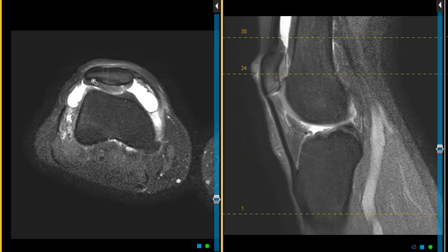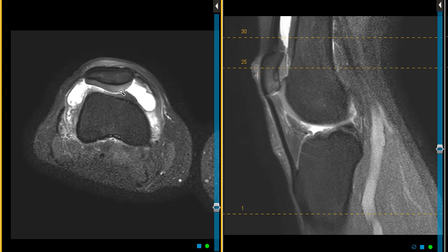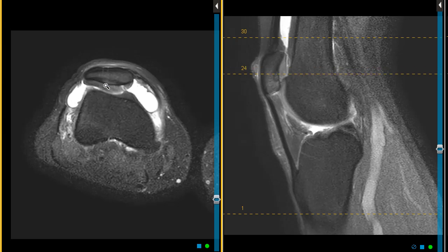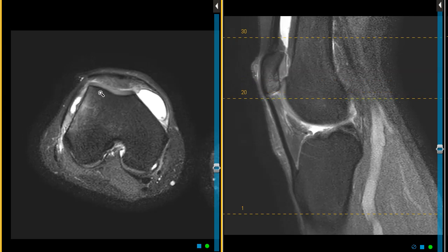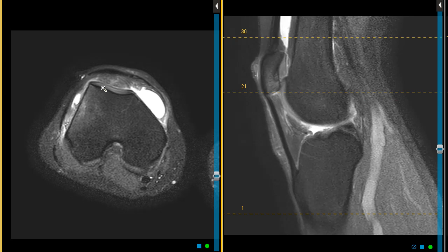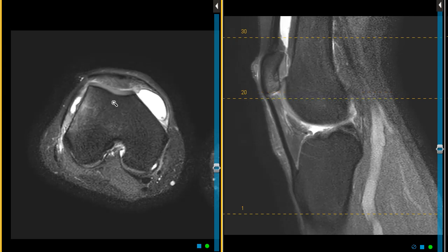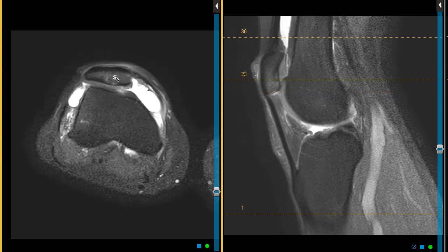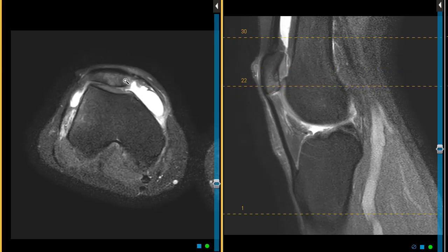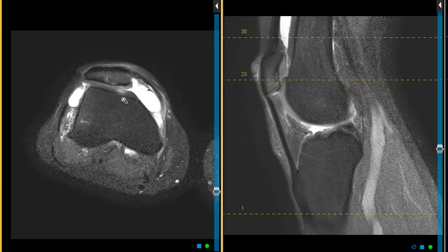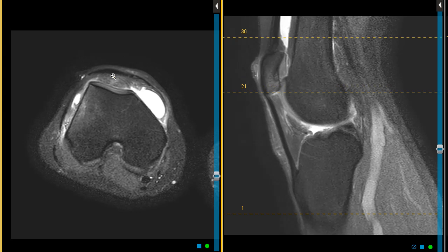We also see that the patellar articular surface is very flat — normally it's a deep V. And the femur here also has a flat articular surface, so they don't have a deep V or deep trough for the patella to sit within. When both of these surfaces are flat like this, the kneecap is unstable, it's not held in here, and it can slip or sublux. With the high-riding patella, it makes it worse.